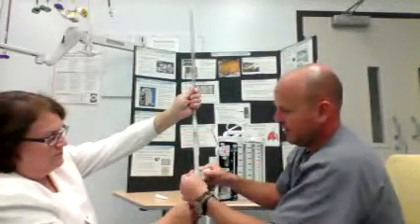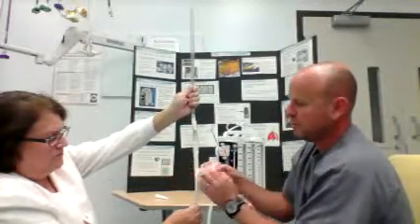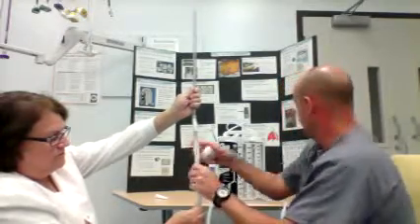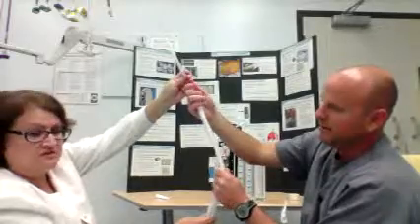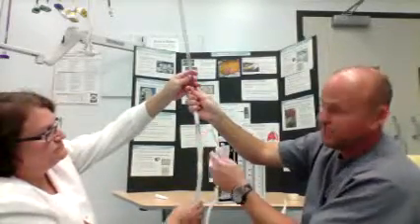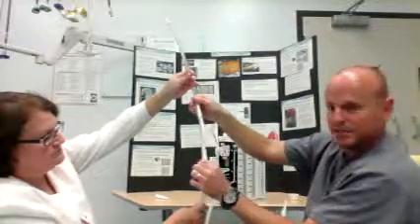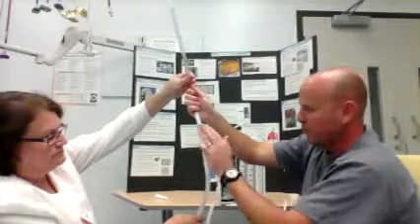Around each side. And this is the best way to secure your closed drainage system tubing to the actual chest tube that's in the patient. It's called the H wrap, because it basically looks like an H. If you have leakage here, you'll be able to see it. And because of the way one solid piece of tape goes across, it's not going to come apart. You can't pull that apart. So this is the preferred way to tape it.